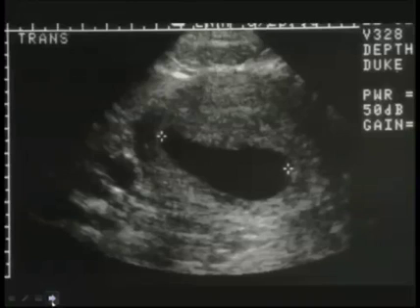This is what it looks like, the large empty gestational sac. And this is where those numbers about when you should see a yolk sac or an embryonic pole become important. Since this is an endovaginal scan, we would expect to see the yolk sac at 8 millimeters and an embryonic pole at a mean sac diameter of 16 millimeters. So this is the large empty gestational sac here.